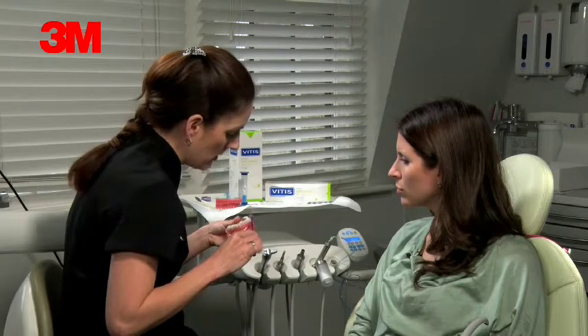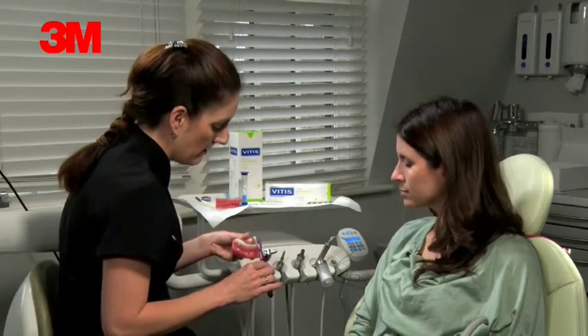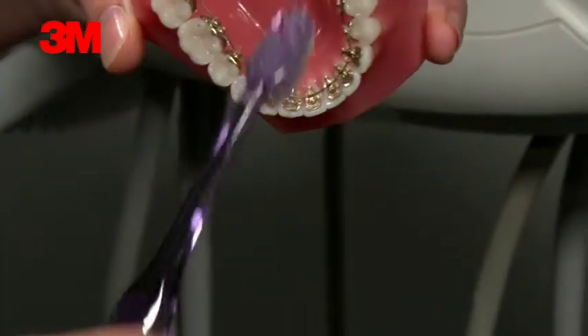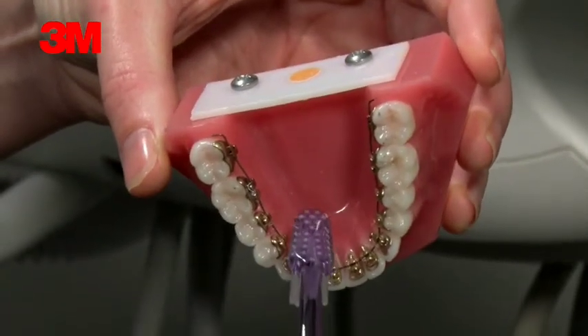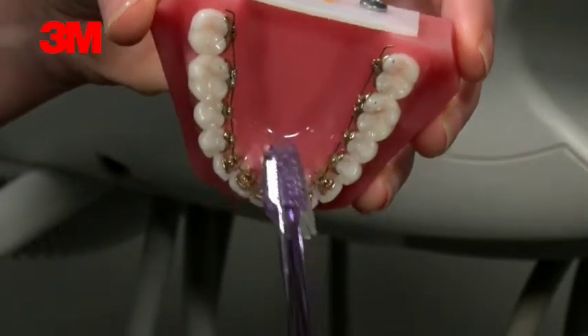You just need to, as normal, brush around the gum margin at the front and the biting surfaces — the same with your electric. And then you get to the inside bit. You need to not only brush the bracket, but make sure you're angling the bristles or the brush, electric or manual, in towards this gum margin here.